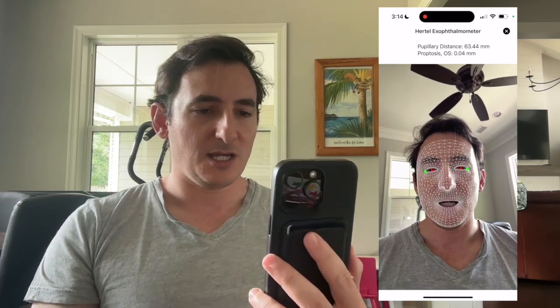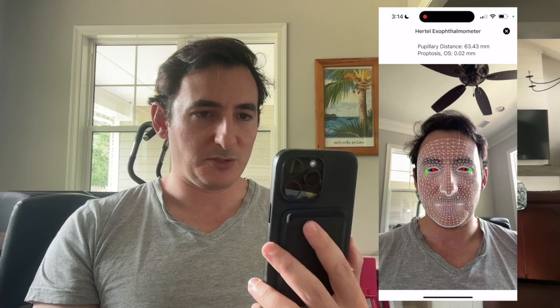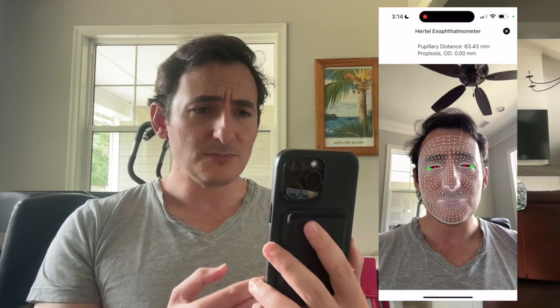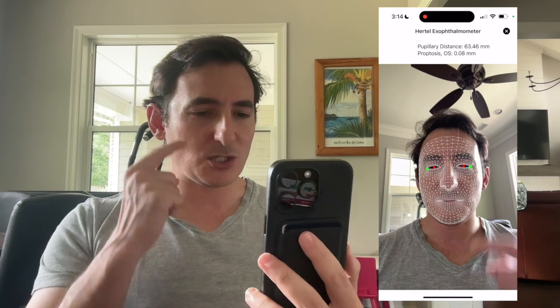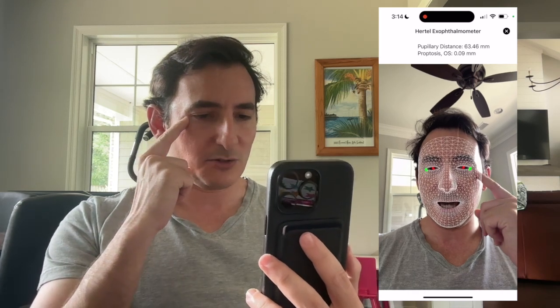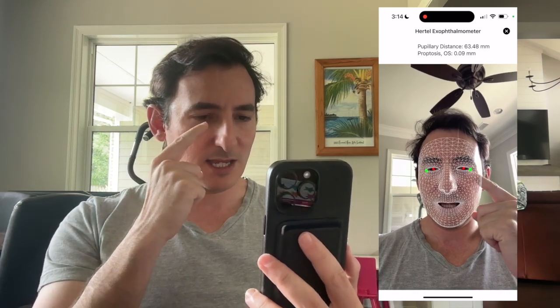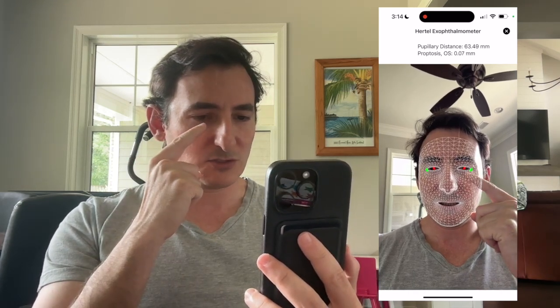At the top it says pupillary distance — my pupillary distance is 64 millimeters — and it will also show any proptosis. To measure proptosis or enophthalmos, it's measuring the lateral canthal rim dot and the distance to the pupil, doing that on both sides and then comparing the two eyes.